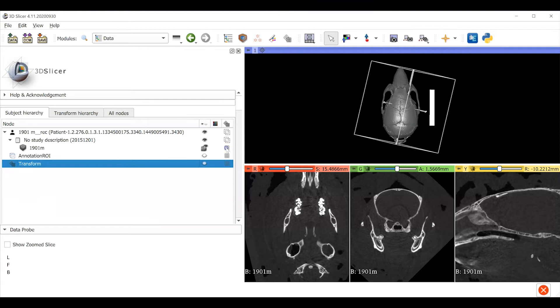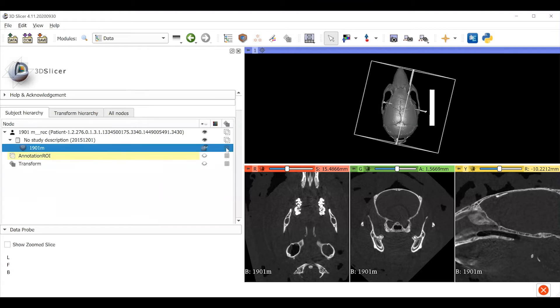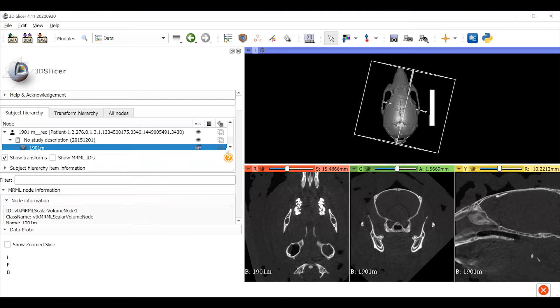This workflow is adequate for collecting landmarks as long as you've saved the transform object. But if you try to export this volume to use in another program, it's going to go back to looking crooked again. And this is because we have rotated the volume in space within 3D Slicer, but we haven't actually changed the voxel structure of the image. If you want to create a data object where the voxels are oriented to the orthogonal planes of the skull, you'll need to use a different workflow.